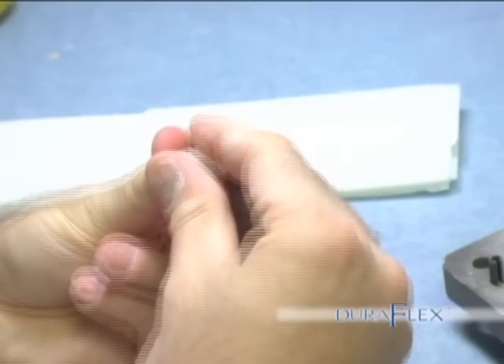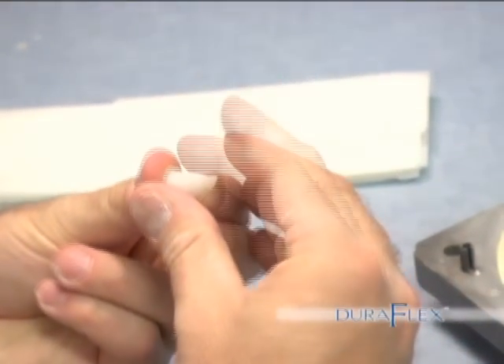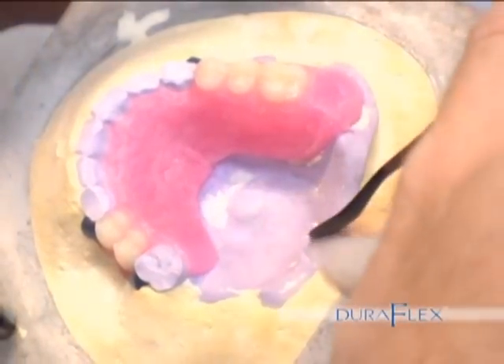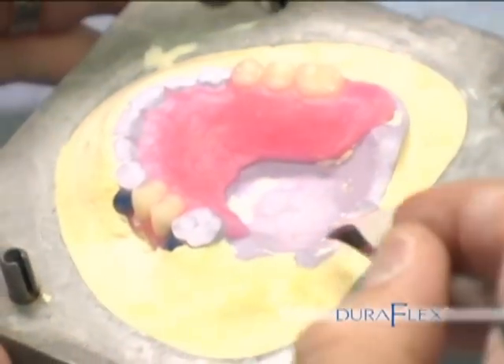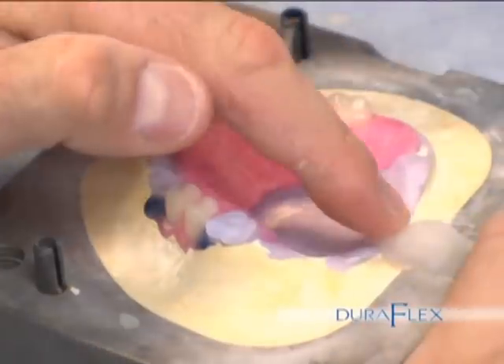Spruing. First, a bullet-shaped piece of wax is created and placed in the channel on the flask. With hot wax, seal it into place. Using 3/16th utility wax, place the sprues on the appliance.